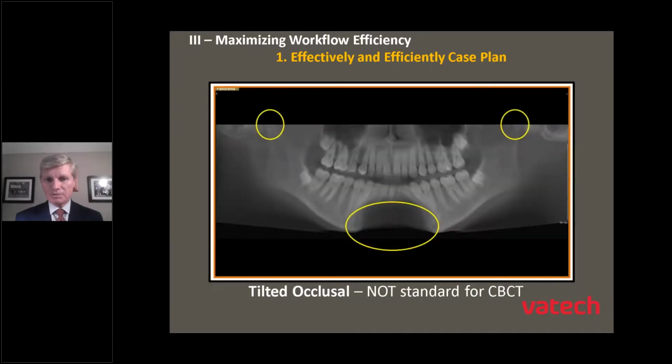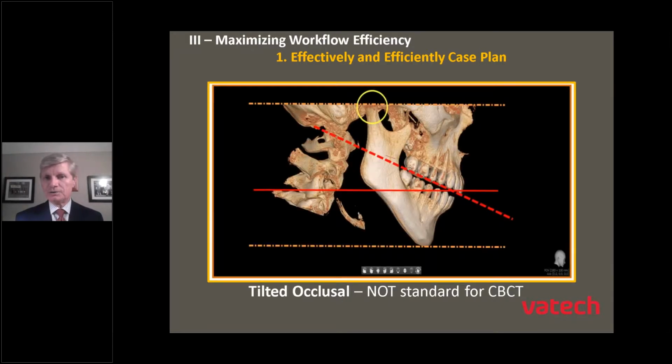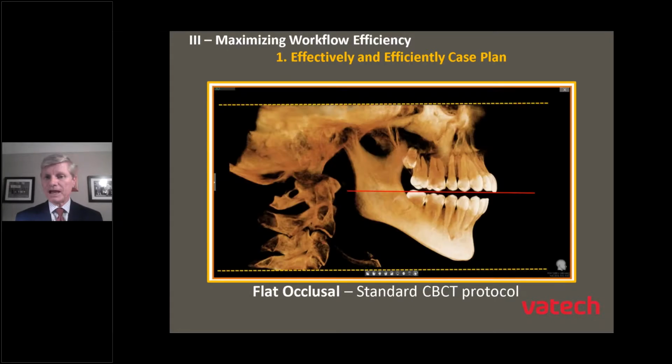Whereas I have had doctors that call me and say, Len, you know, how come the mandible's gone? It looks like there's no bone there. Well, within 3D technology or 3D software, we're always looking at depth of anatomy. So in this case, the thickness of anatomy that we chose to view to generate this view didn't include that region of the mandible itself. So it appears that there's no bone there. Okay? Nothing wrong with the data. It could be manipulated to generate a better view, but it was determined to take another CBCT scan of the patient, and by doing so, the occlusal plane was flat, as you see here.